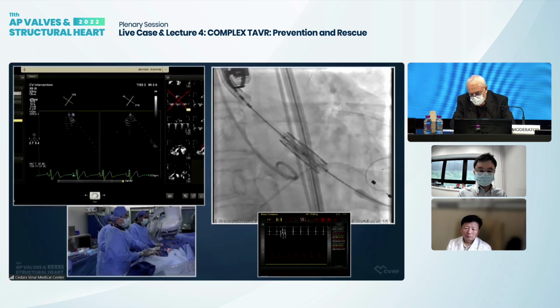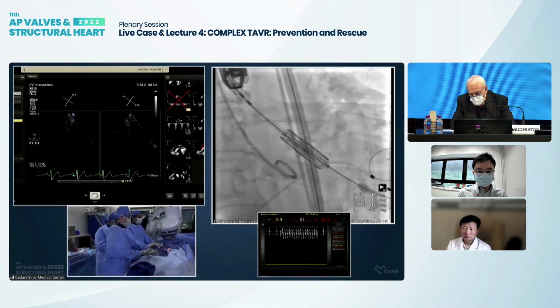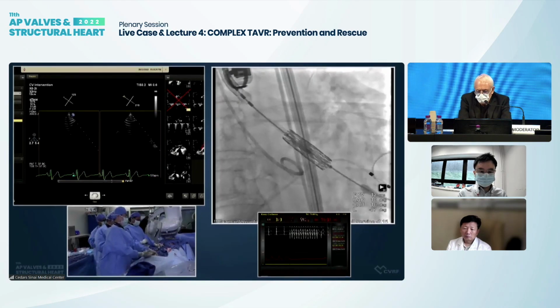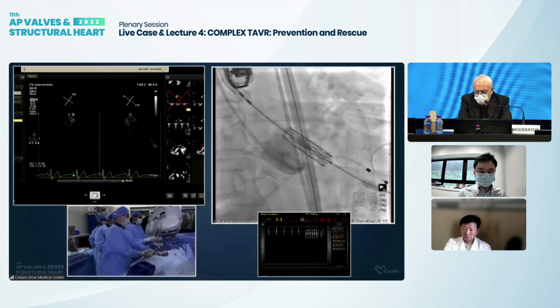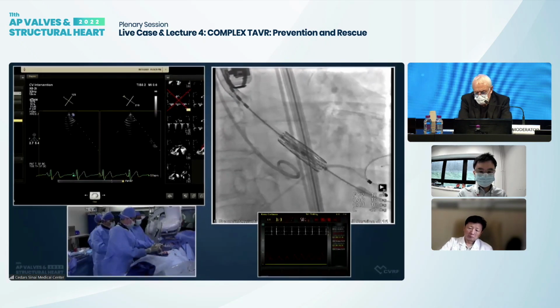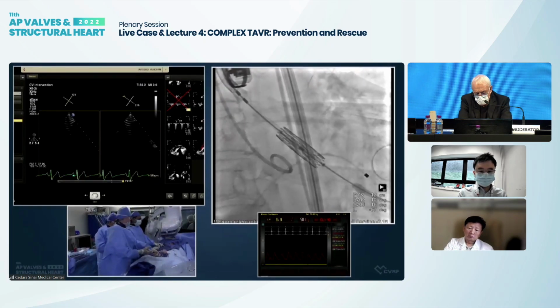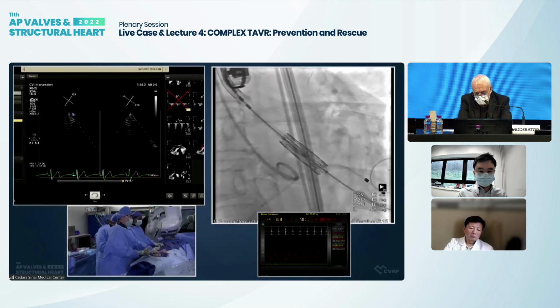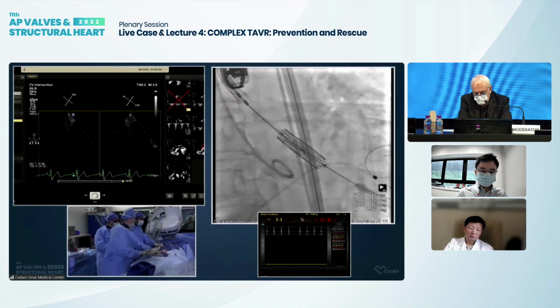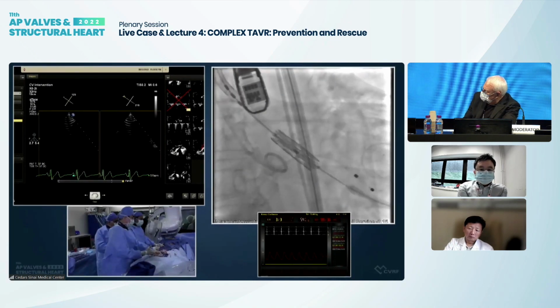Yeah, pace around. Okay, inject, please. All right, off, please. Okay, what do you think? Yeah, I think nice. All right, so the key is to keep it there so it doesn't move up. Are you satisfied there? And what do you think, Aziz? I think we are okay. We need to push a little bit harder than usual, but it's probably going down. All right, you agree?